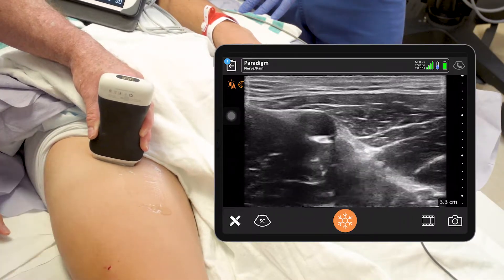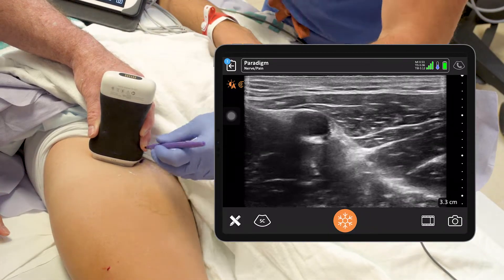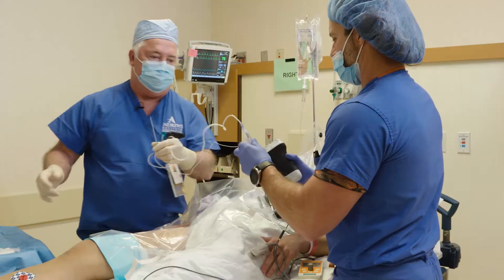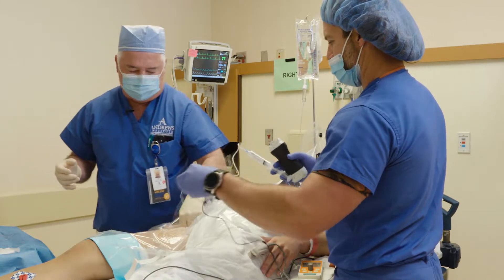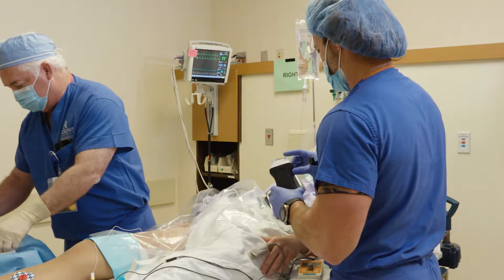We're going to put our catheter down the leg. Let's mark that and see where we're going. We're going to flush through this really well, make sure there's no air in that line, because the air will really mess up our ultrasound image.